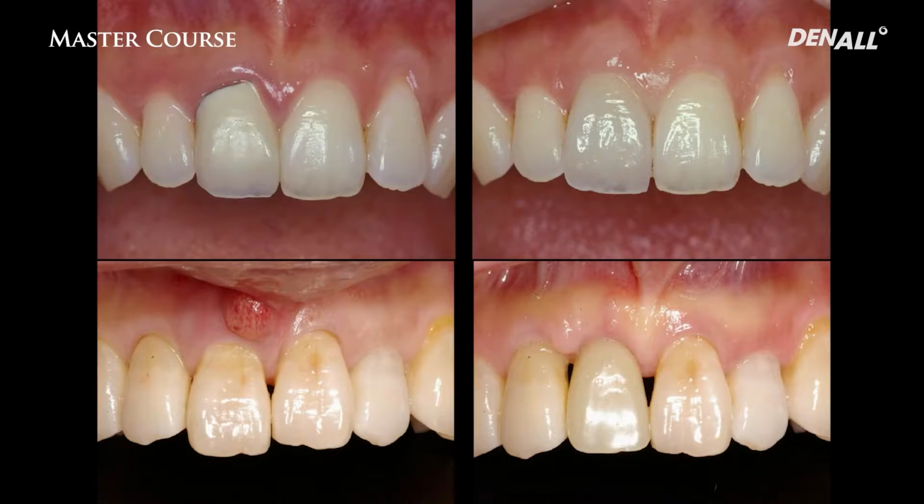The upper photos, when there is no lesion, and when we make prosthesis where there is a lesion, there's a difference. What we know is different from what we can do. There are some things that we cannot avoid even though we know about it. How can we avoid it? And how can we maintain the situation?